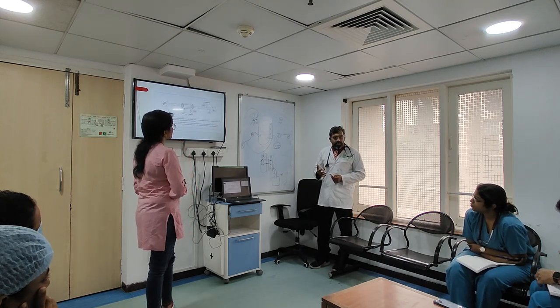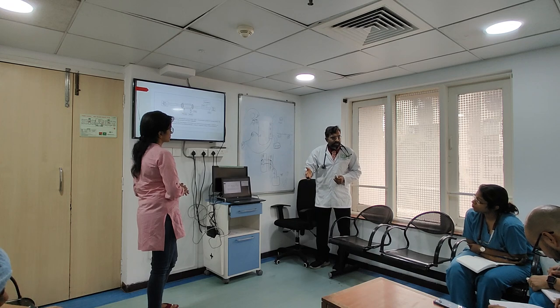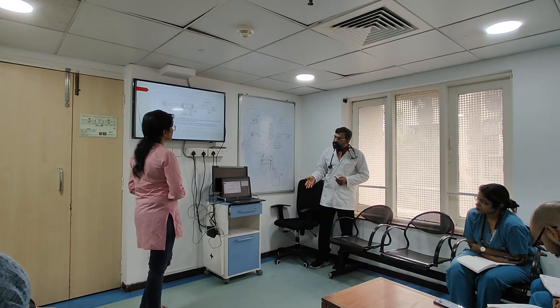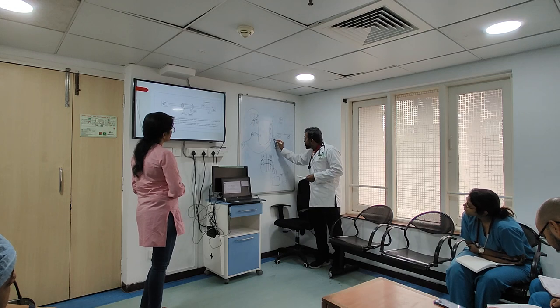The only difference is, instead of a replacement fluid coming in, I will have a dialysate fluid, and that dialysate fluid will have a separate pump, a dialysate pump for it. Understood? Running all this, there would be another pump over here, which is called the effluent pump.